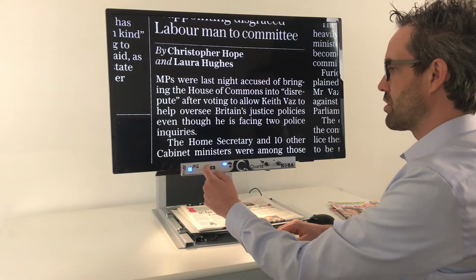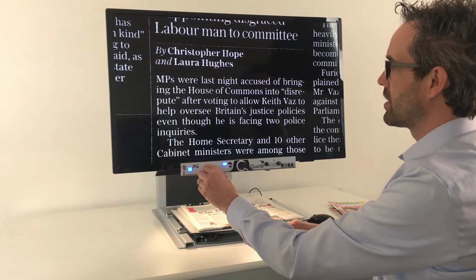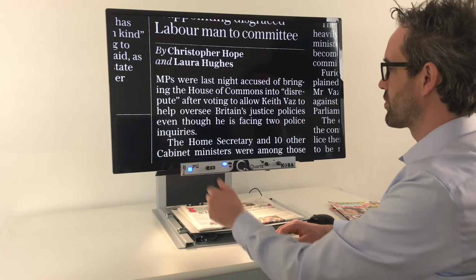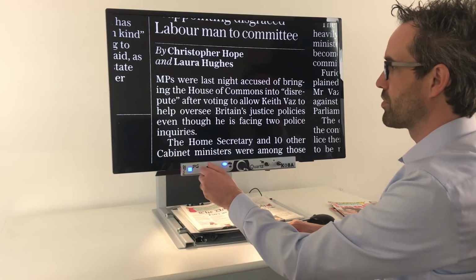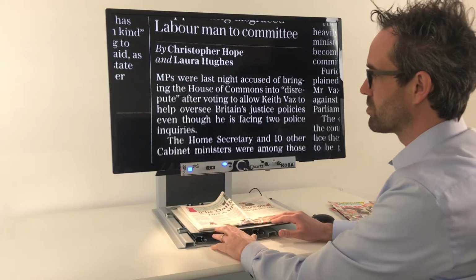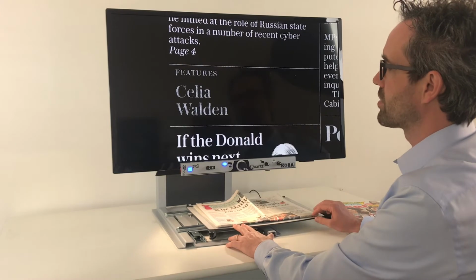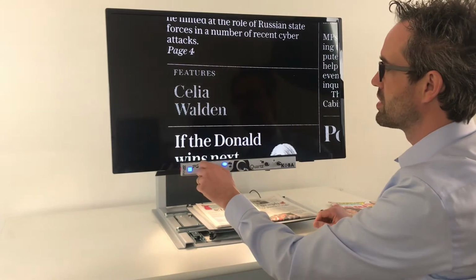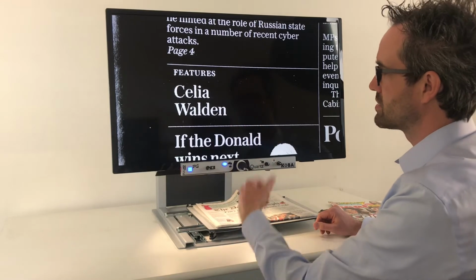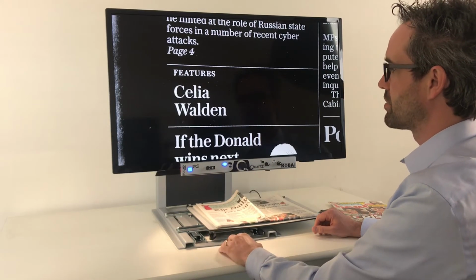On the left side you also have a small tracking wheel. With this you can change the background, less background, more background. That's interesting, for example, for newspapers. Like here you have a nice clean picture, but sometimes, for example here on the left side, less background, more background. Then it's brighter, and in that case it's better.